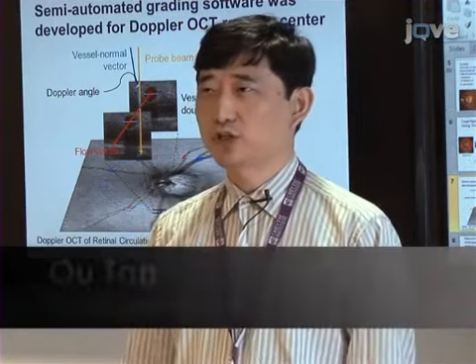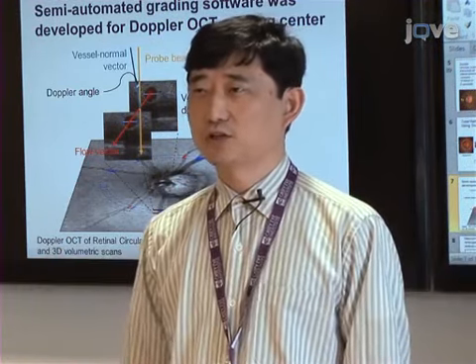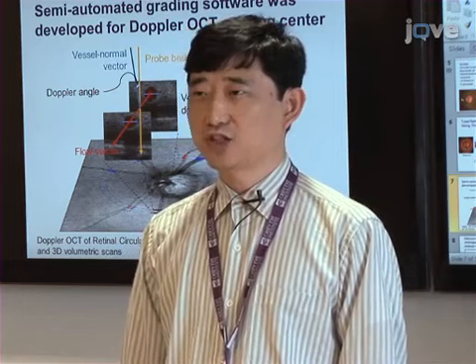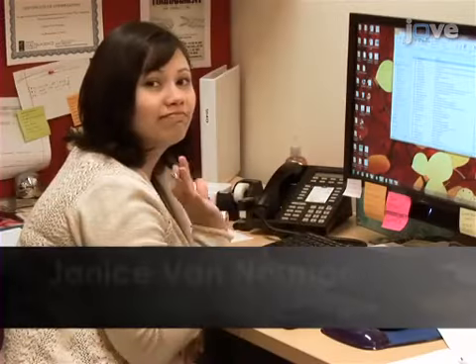Video demonstration of this method is critical as the steps are difficult to learn, and because the accuracy of the result depends on the image quality and the subjective grading of vessel position. Demonstrating the scanning procedure will be ophthalmic technician Janice Van Norman.